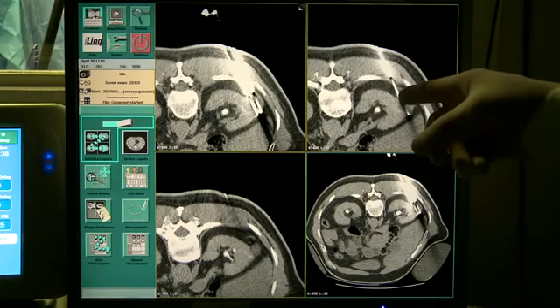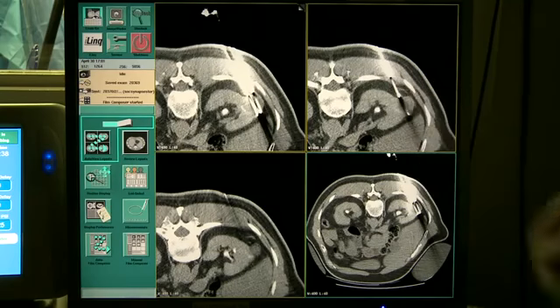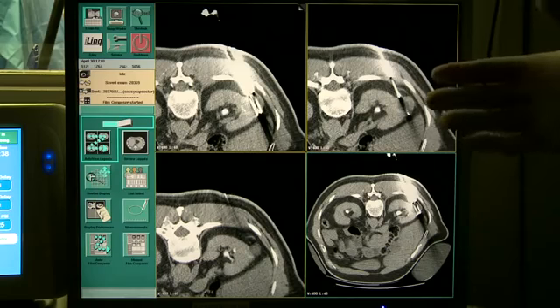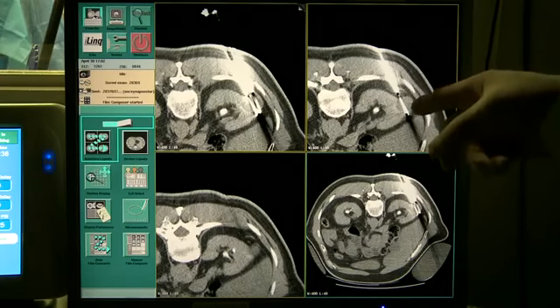If you want to bias, if you don't want to be in the center of something, you want to be closer to the parenchyma of the kidney, because that's a warming source, whereas the lateral aspect won't have the heat of the kidney, and it's easier to freeze. So this is the upper probe. It's now in place, well centered.